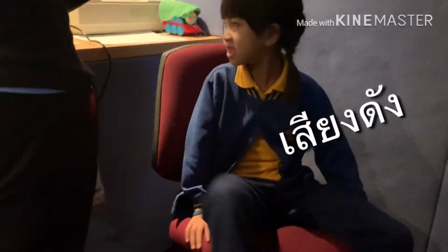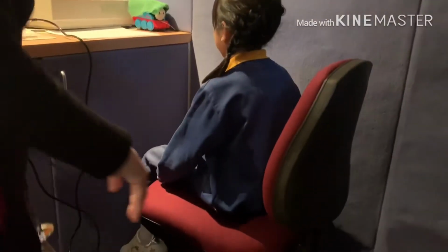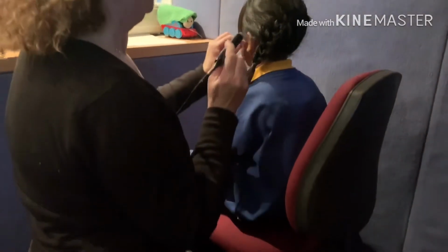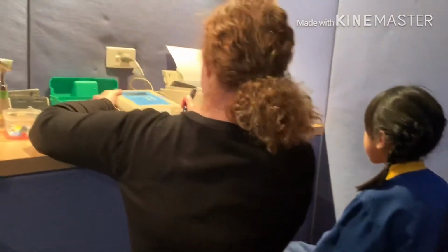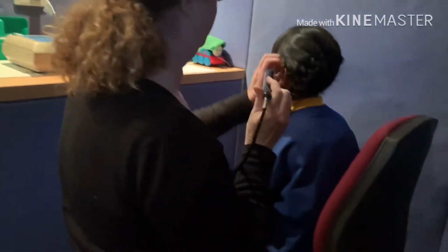That looks very good. Now we do the other ear. That's so good. It's great having bigger kids that can do it. Okay, so we got it on, sorry. Put it on the left. Yes, no data, it says. Sorry, I don't want to pull your hair.